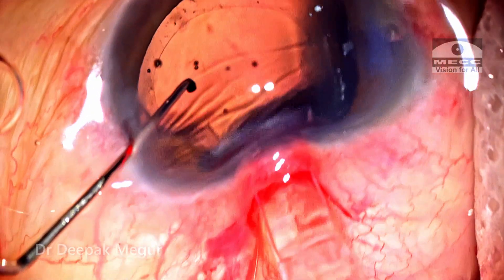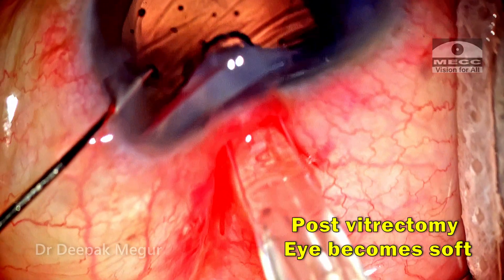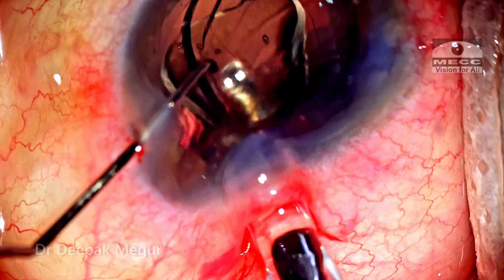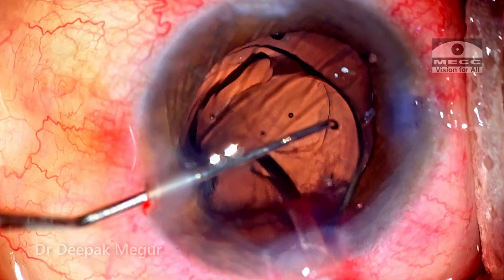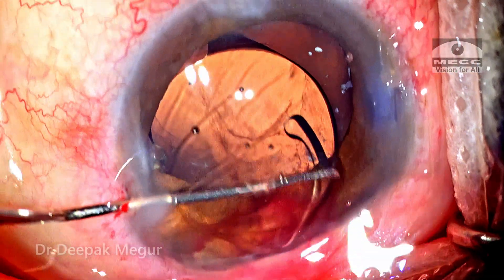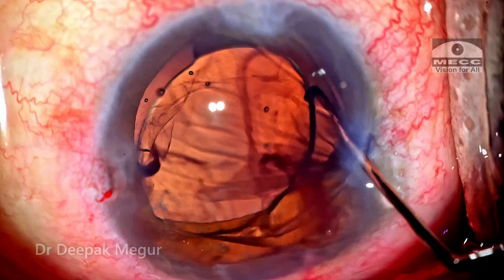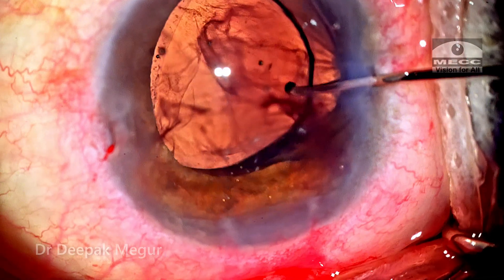As I'm introducing the cartridge through the wound, you can see severe corneal folds because the eye is very soft. In a post-vitrectomized eye it's difficult to maneuver simply because the eye is too soft. Nevertheless, I could ensure that the lens was gently maneuvered into the bag. I needed to be absolutely sure that the haptic had gone under the capsule and above the posterior capsule, not beneath the posterior capsule opening. Thankfully, it landed in the right space.